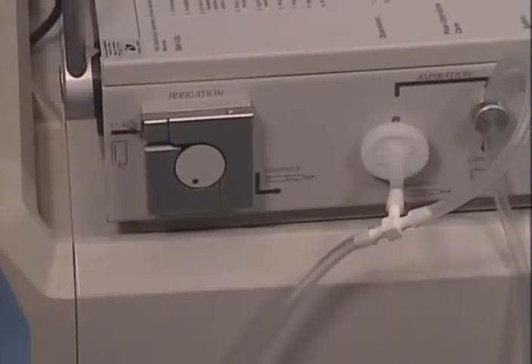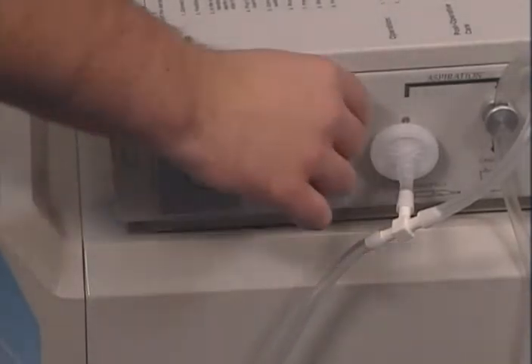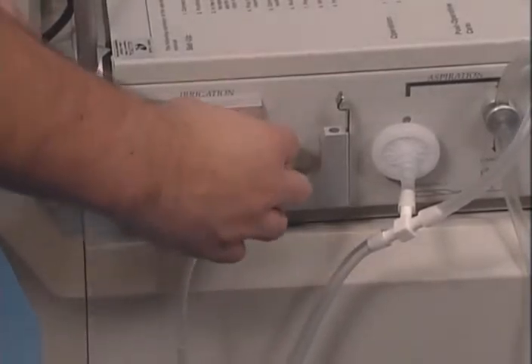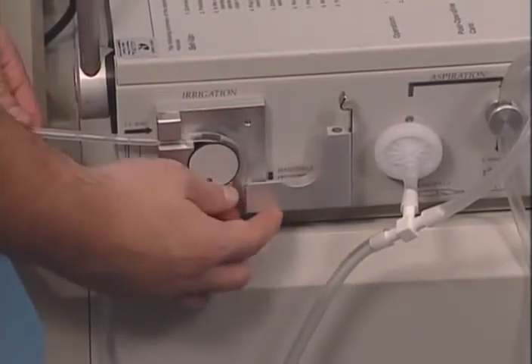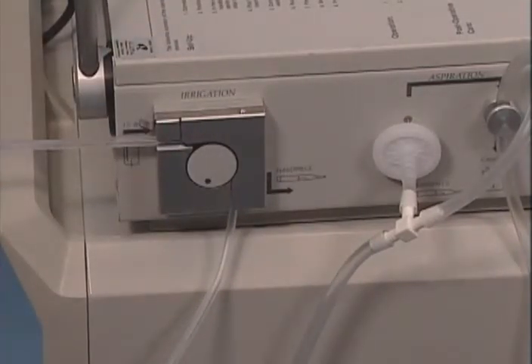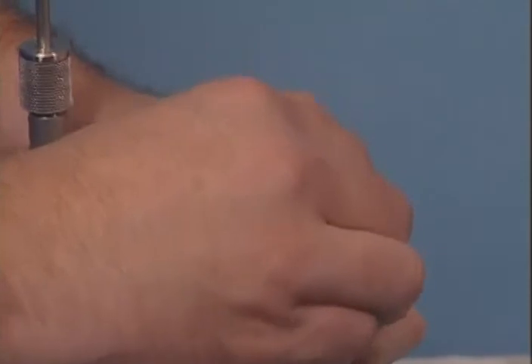To route smaller irrigation tubing, first, unclip the latch of the peristaltic irrigation pump. Place the IV tubing over the roller of the pump. The spiked and capped distal end will exit the top of the pump next to the irrigation pole. Close the latch, ensuring the latch is pressed firmly down. Remove the cap from the spike on irrigation tubing and spike the IV bag.